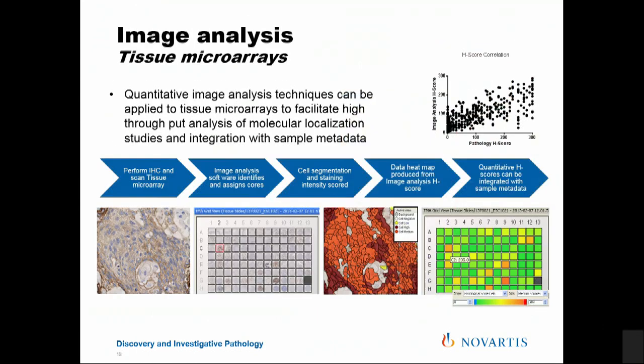Image analysis can also then be applied to the tissue microarrays. As I said, when you have these automated platforms up and running and you are assessing tissue microarrays, you can assess literally thousands of tissue cores in a single day. Those cores still have to be assessed, and the image analysis can help us with this.